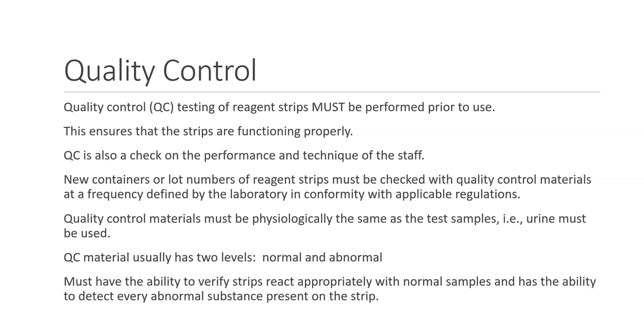Quality control or QC. We are QC'd to death in the lab. Sometimes I feel like I spend more time doing QC than I do actual patient testing. But QC testing of the reagent strips must be performed prior to use. And this ensures that the strips are functioning properly. What if the truck that was bringing these strips to the lab broke down in Texas in the middle of summer? Well, the temperatures may get so high in the container that it could adversely affect those strips. So QC is a must.